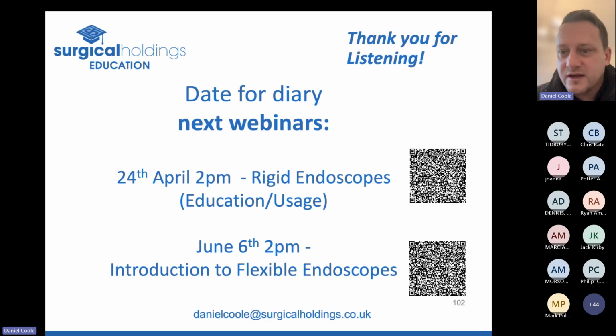So, also another comment about how we can avoid rusting instruments: trying to work with theatres, trying to encourage them to rinse off the saline, because you will 100% get rust if you're using saline and it's not being rinsed off. The other challenge is that a lot of these devices are often left in situ for a bit longer. So not only are they in contact with saline potentially, but they're in situ for a bit longer, so this saline will be sitting on them. So getting them rinsed off, or ideally getting something as an alternative to saline used, would be good.